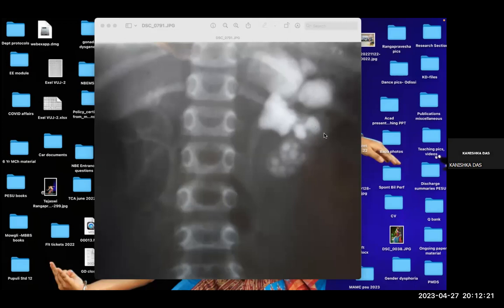What is the importance of this dumbbell calculi? Is there any surgical importance for you to know when there's a dumbbell calculi? Is removal of this dumbbell calculi easy or difficult? It is difficult because it is going through one space, through a narrow ostia, and then another one. When you remove it from either side, it tends to break here. So that is a technical problem in dumbbell calculi. Removal of the other calculi will be relatively easier. There are chances of leaving a few calculi within.